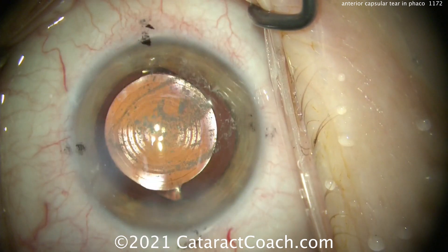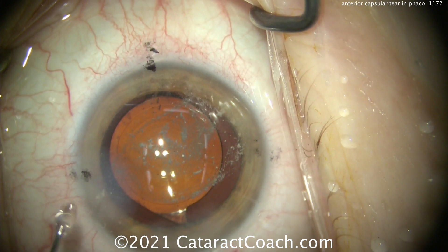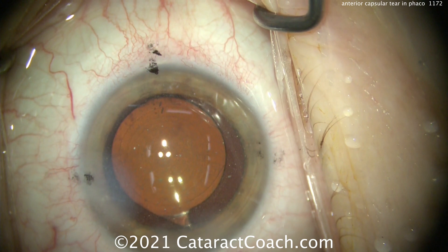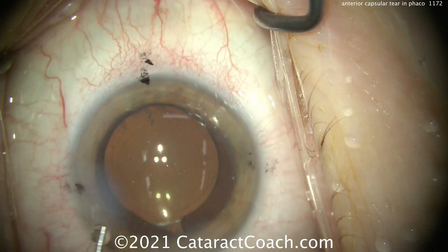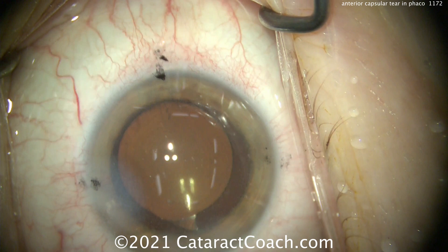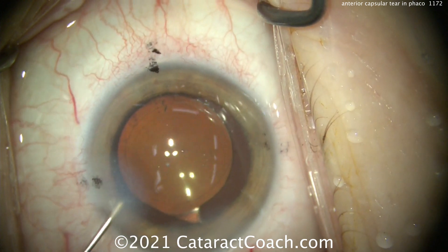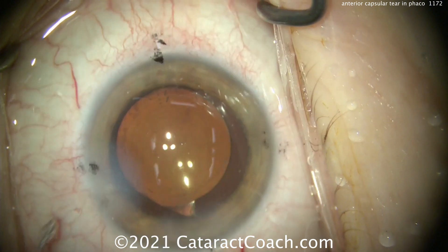So finish up the case here — the patient had a really nice outcome. And this is something you may have to deal with. Putting a little triamcinolone here to help quell any post-op inflammation. It'll also show us if there's any retained viscoelastic. That looks great. And then putting in, finally, some preservative-free moxifloxacin. There it goes to the very end — and that should do it.